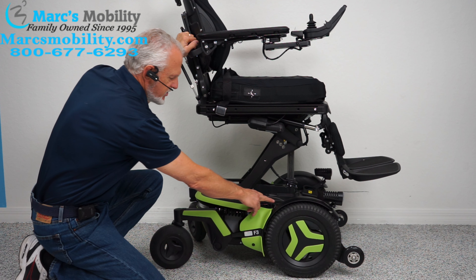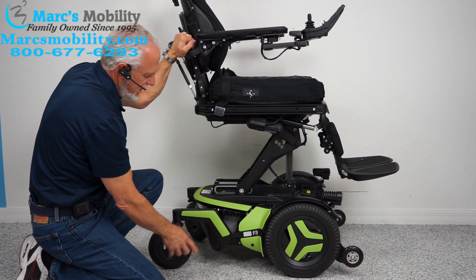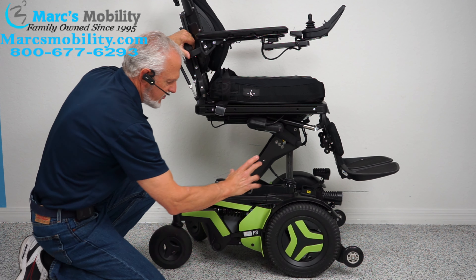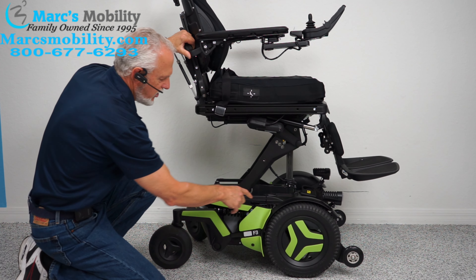You have suspension here for the front and suspension here for the back. If I move this, you can see the suspension actually moving. That suspension is adjustable by turning the ring right here on both suspensions. So you have suspension for this half of the front, suspension for this half of the back — same thing on the opposite side. You have 4 of these suspensions.